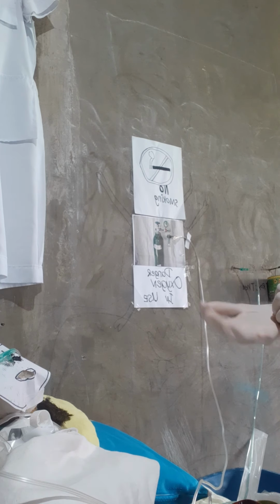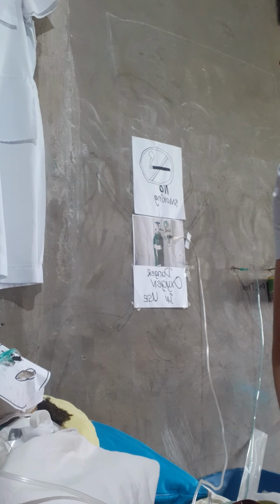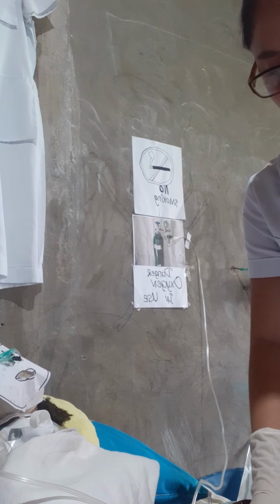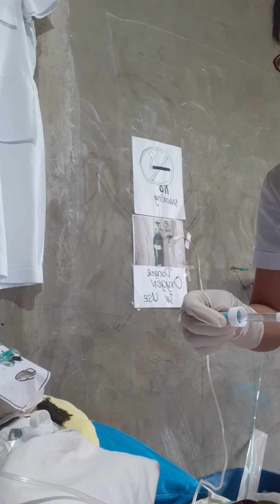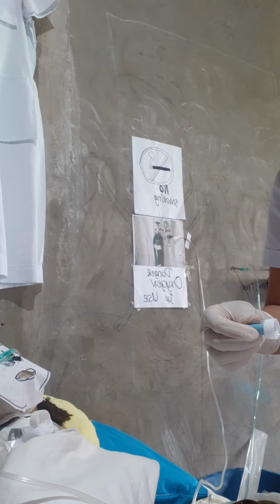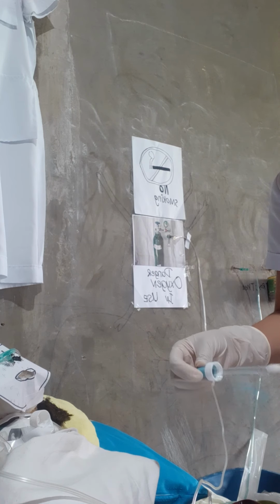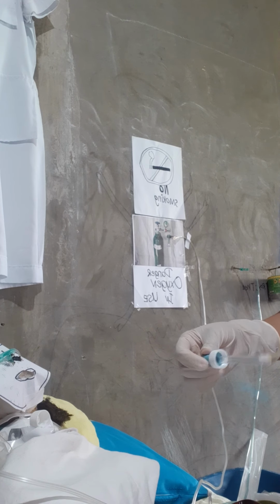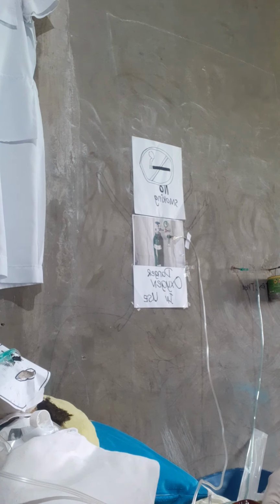Then we need to remove the inner cannula from the soaking solution. Moisten the brush with a cleaner. We need to clean this one. Then we need to tap it.